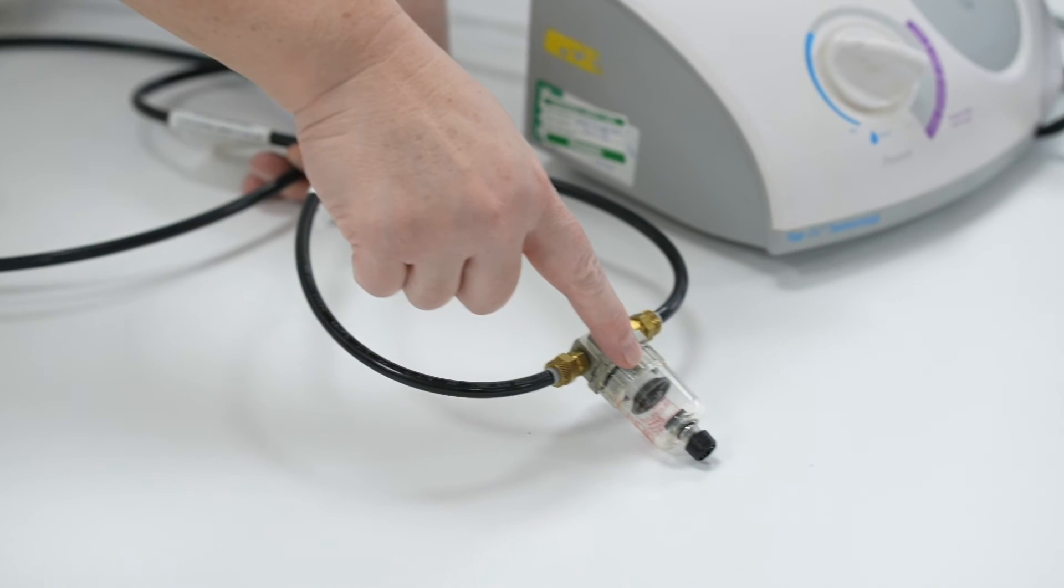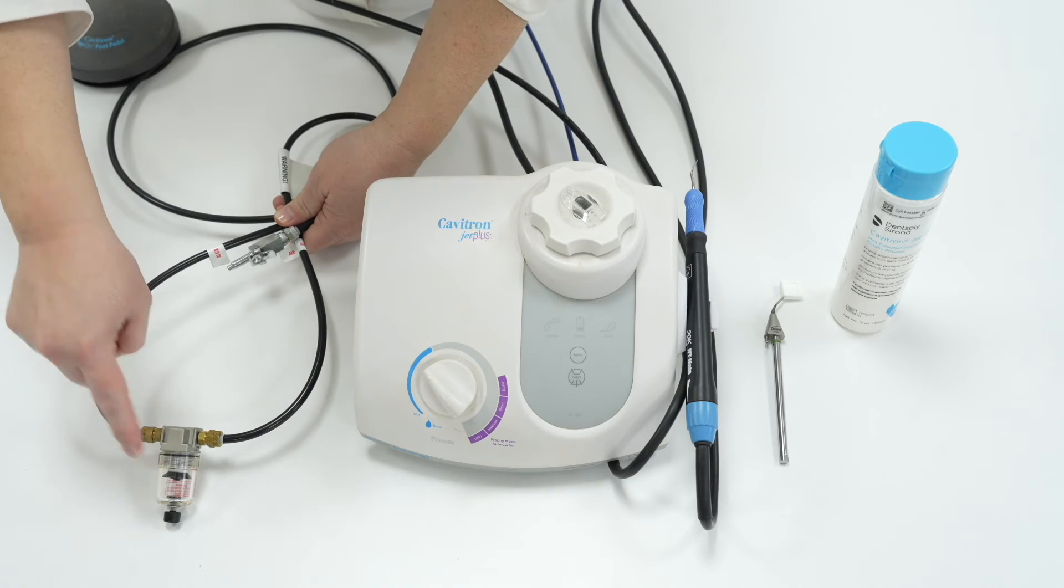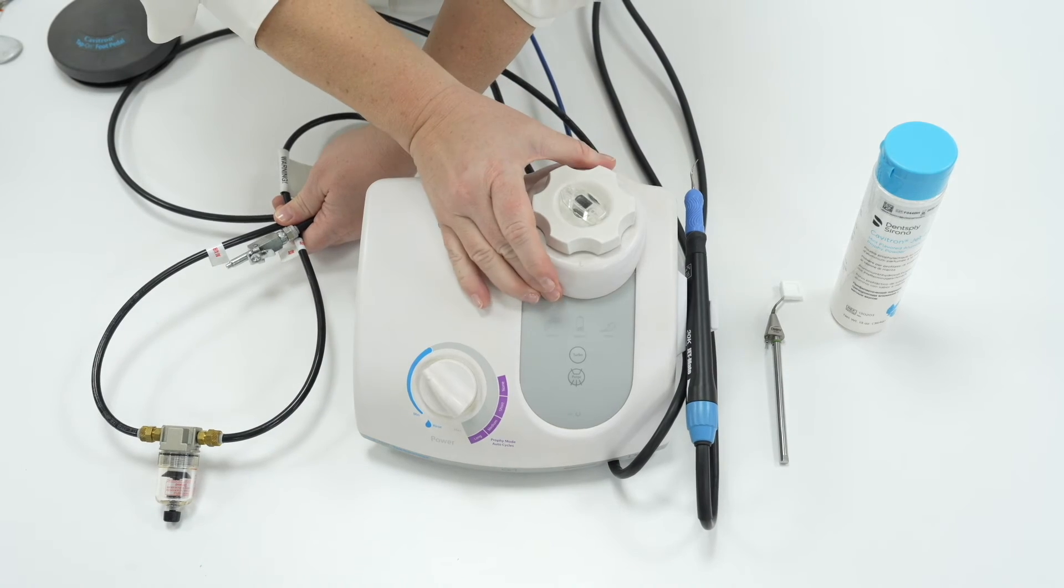If you ever see water in the air line clear pot or in the powder pot, this means that the air and water line has been mixed up and the Cavitron has been accidentally flooded.